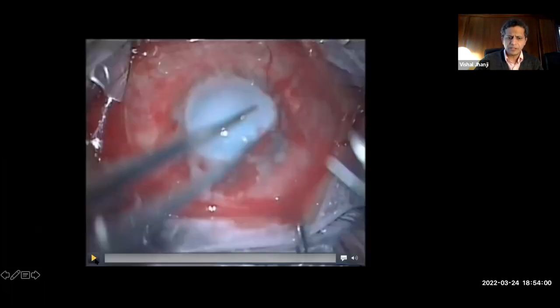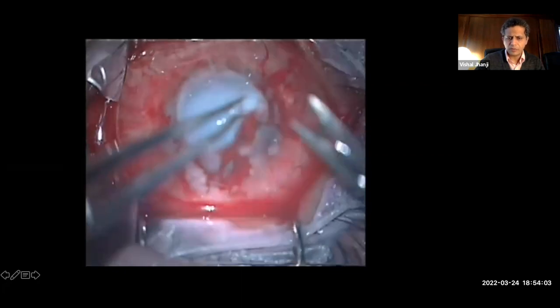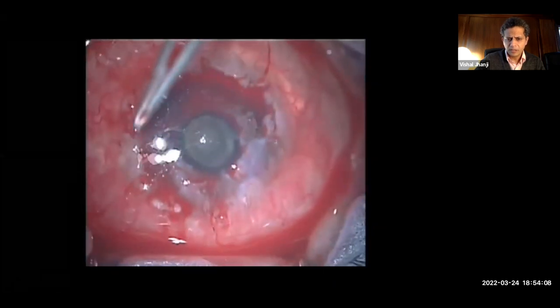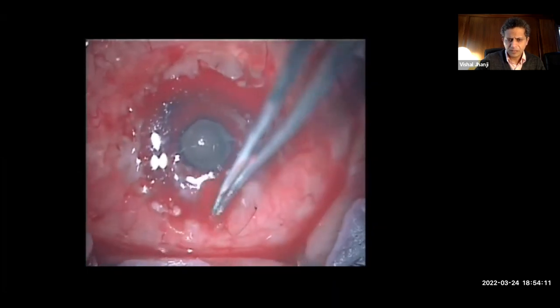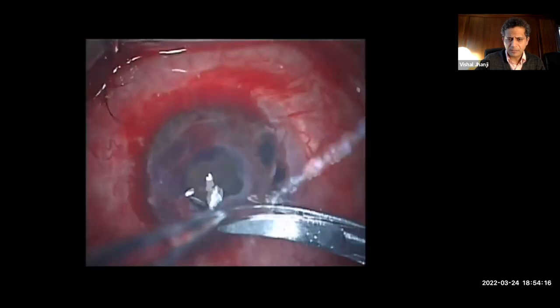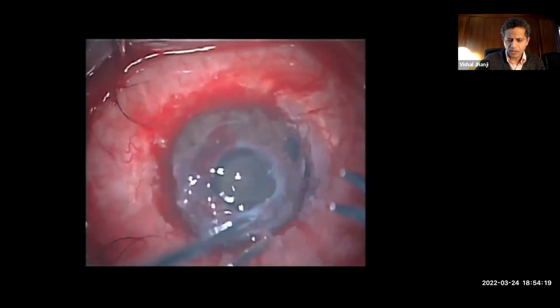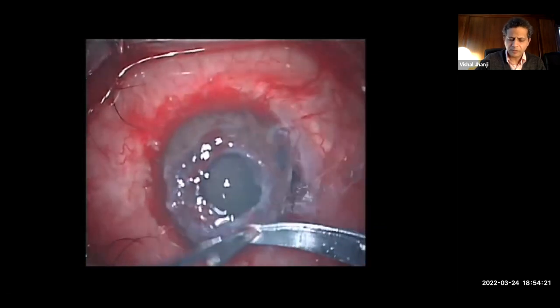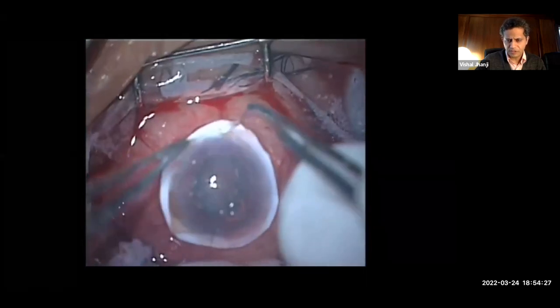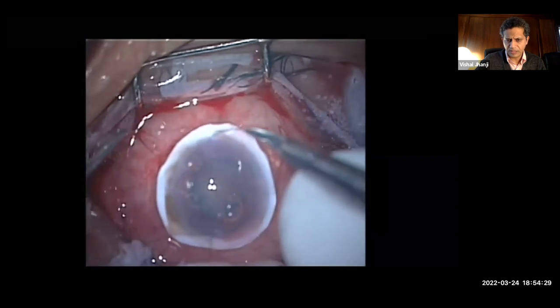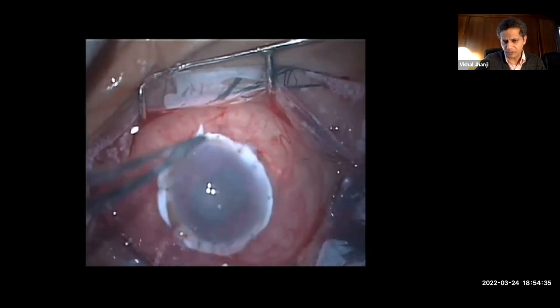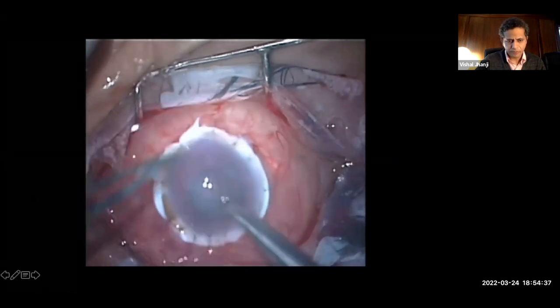This video shows a massive corneal infection — the whole cornea is involved. Once you take up the whole cornea, there is a membrane on the iris; a large part of the iris is actually necrotic. A large graft is done with clearly freehand dissection. This graft is not going to stay on the eye with 16 stitches — you will need at least 24 stitches for a patient like this.